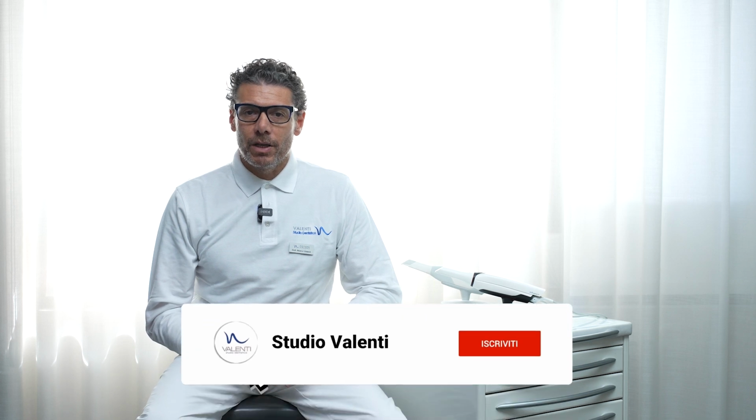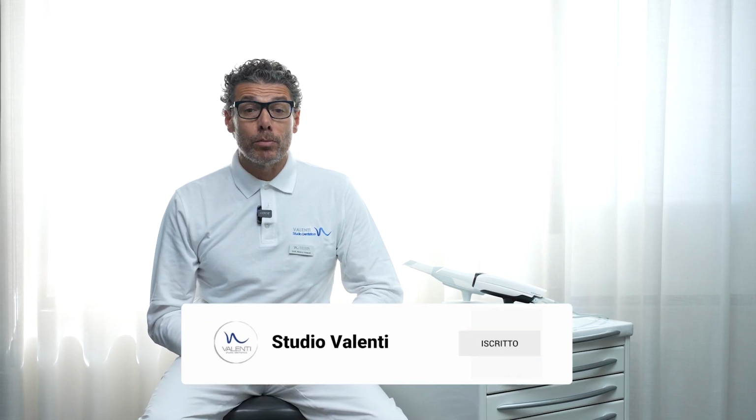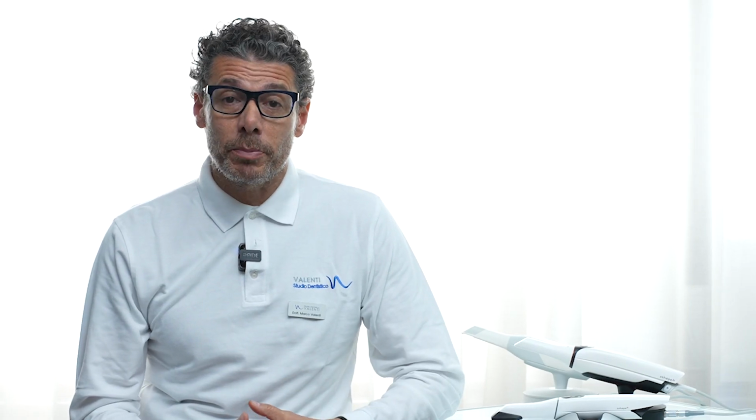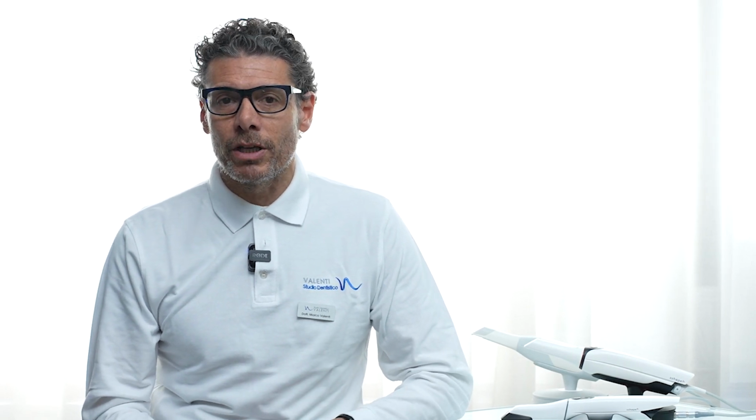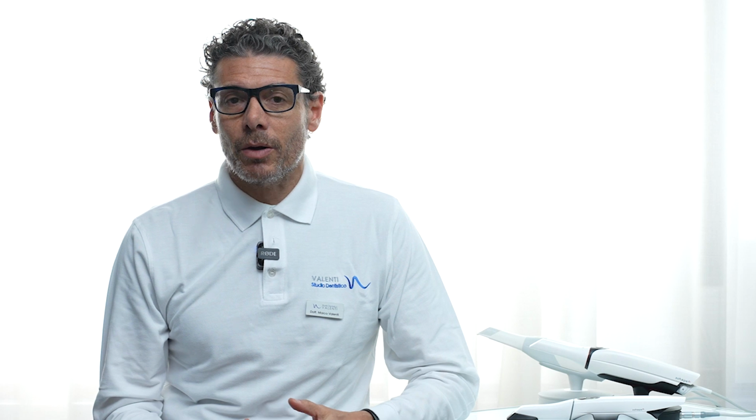Today we will take a look at the use of the face scanner. The face scanner is a very useful tool for dentists. It allows us to take a three-dimensional facial scan, a 3D file that can be sent to our dental lab. The lab will use the patient's face scan, this three-dimensional file, to design teeth and make assessments regarding the aesthetics between what will be the digital mock-up and the patient's face.